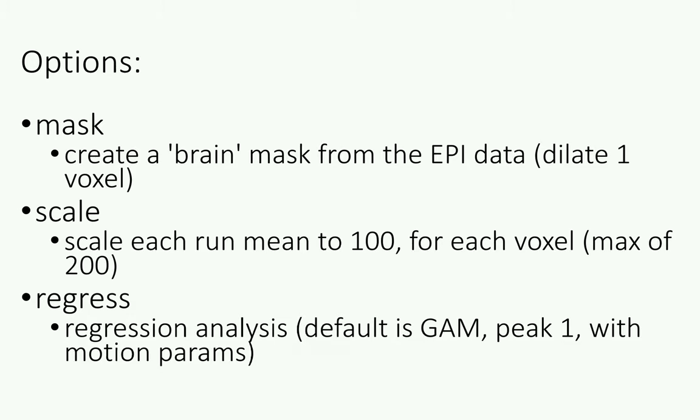Quickly, masking. The masking step is to use a brain mask to drop things from outside the brain, but you can also use it as far as inserting. It'll be the block which you handle inserting masks of ventricles or things like that you might want to use as a noise regressor.